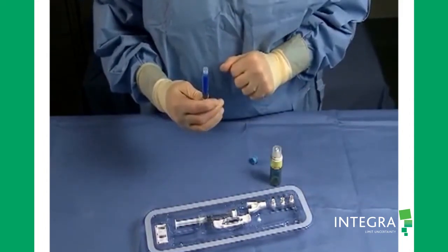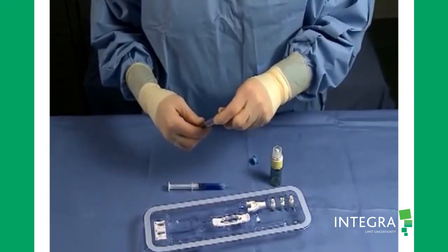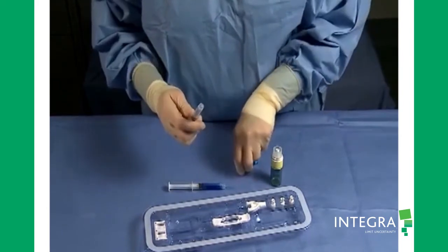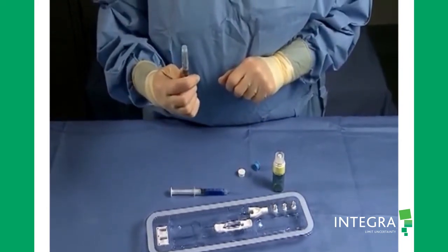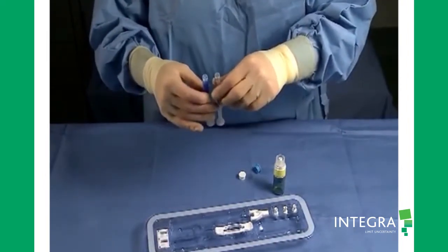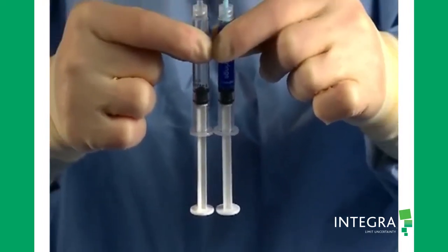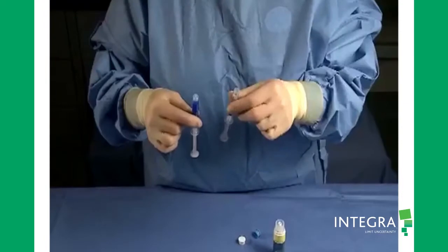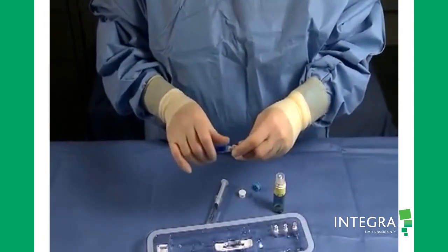Remove the air and level the contents of both syringes so that an equal volume is in each. Attach both syringes to the DuoFlow applicator.